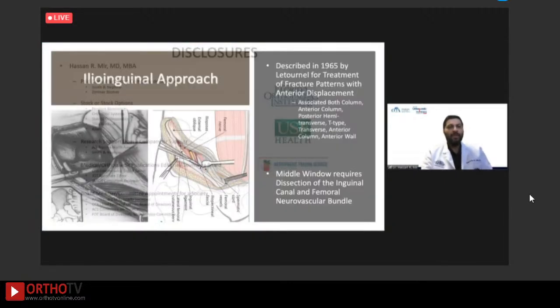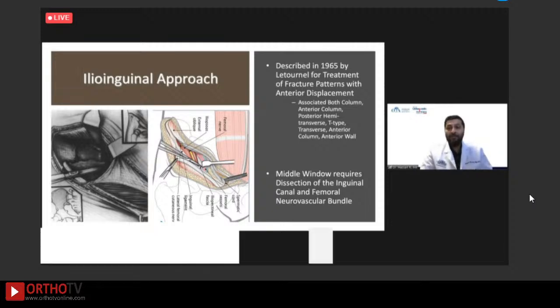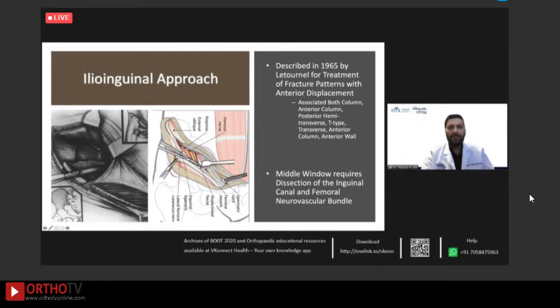Again, my disclosure. So the ilioinguinal approach is what I was initially trained on and what probably the vast majority of pelvic and acetabular surgeons initially learned. Some of our trainees now have not actually done this approach and are only learning the AIP and modifications. But this was initially described in 1965 by Letournel, and it's for patterns with anterior displacement. So all the patterns you see there. And the middle window, which is very valuable for reduction and implant placement.